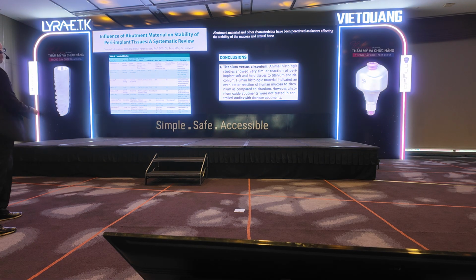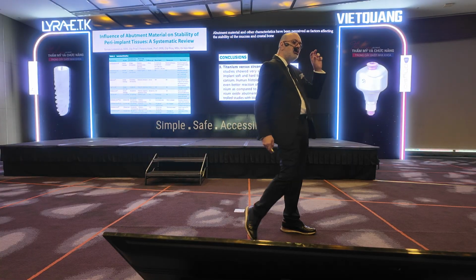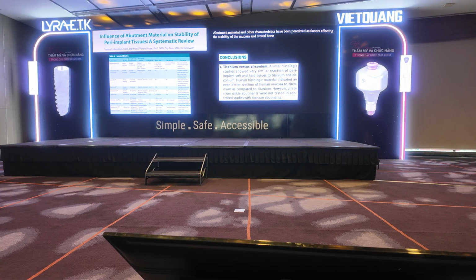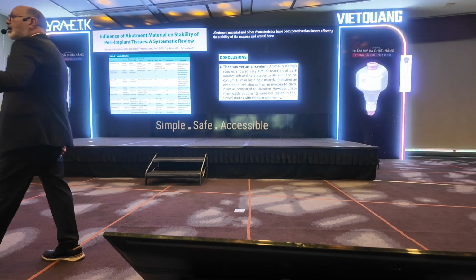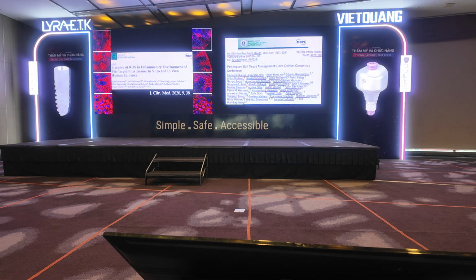So these are some papers published on this one abutment one time, showing that when you remove the abutment, you put the scan body, you remove the scan body, you put the final restoration. In all those back and forth, you contaminate inside the soft tissue, and for sure you will never have a sealing, you have a healing. And the healing is totally exposed. If your patient does not brush well, you will have bacteria inside the sulcus and the problems you saw this morning.